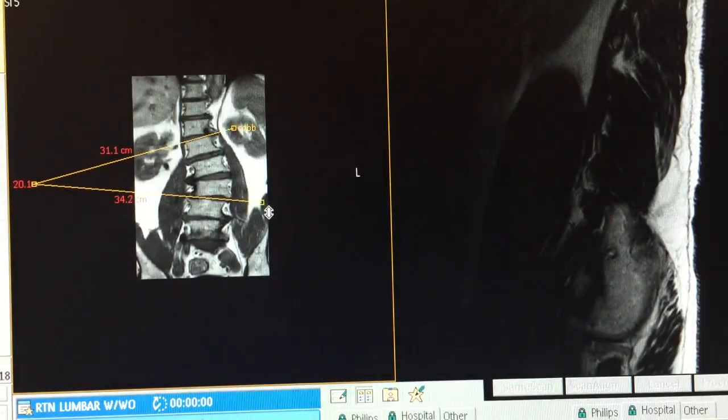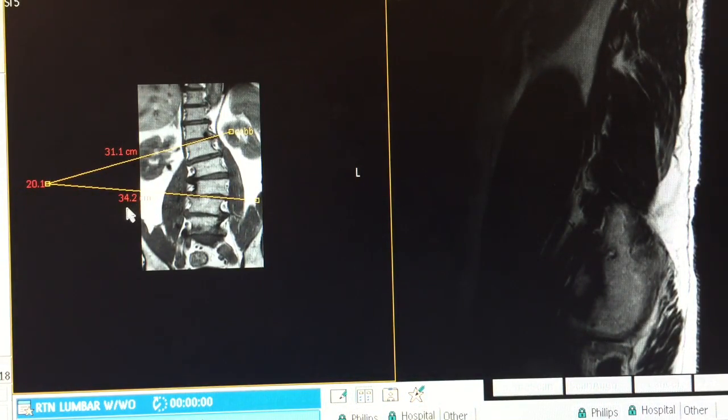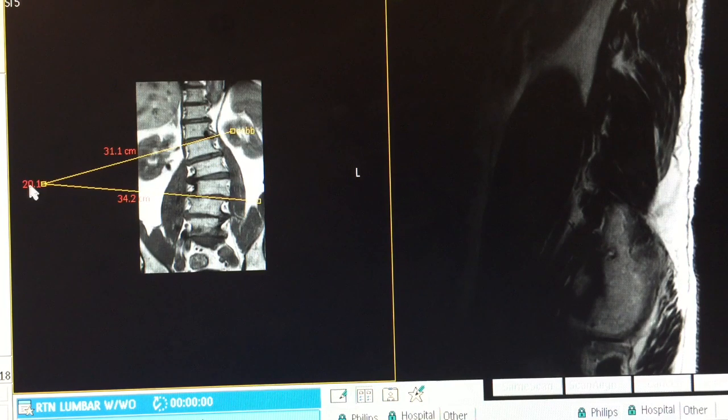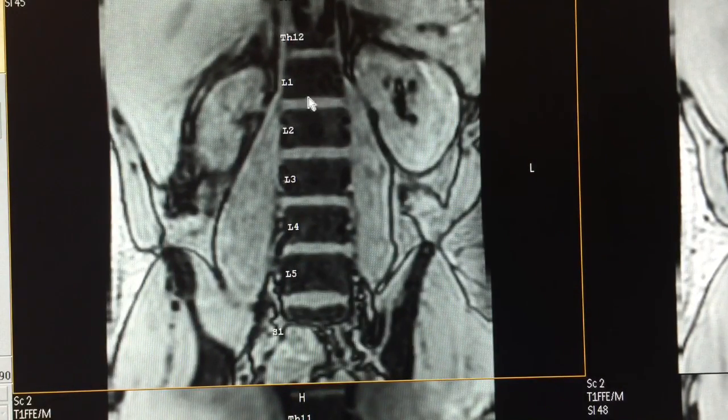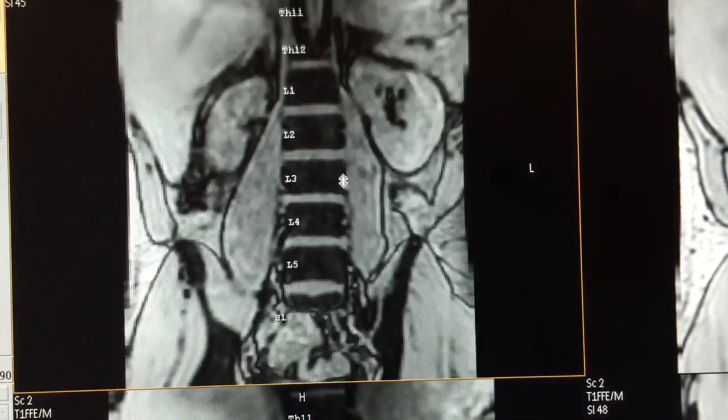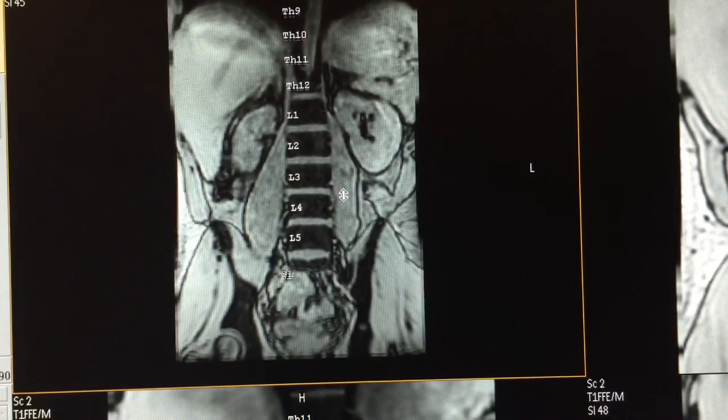Zoom out and here's my reading — 20.1 degrees. Now let's switch quickly to a spine that is very straight — almost a perfect spine scenario.